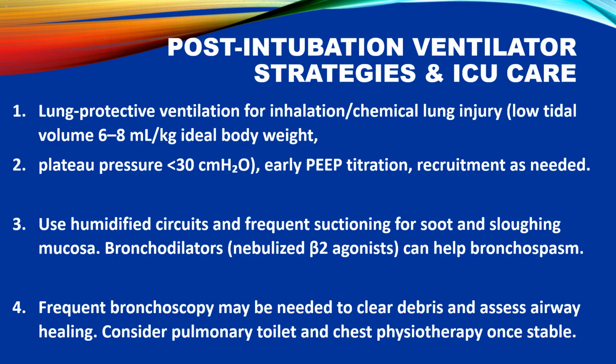Early PEEP titration helps keep the alveoli open, improve oxygenation, and prevent atelectasis, which is common after inhalation injury. Recruitment maneuvers can reopen collapsed lung areas, but they should be used cautiously to avoid hemodynamic compromise. 3. Humidified ventilator circuits prevent drying and crusting of airway secretions, making suctioning and clearance easier.